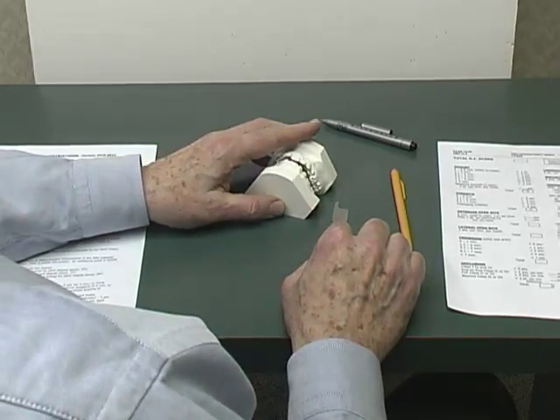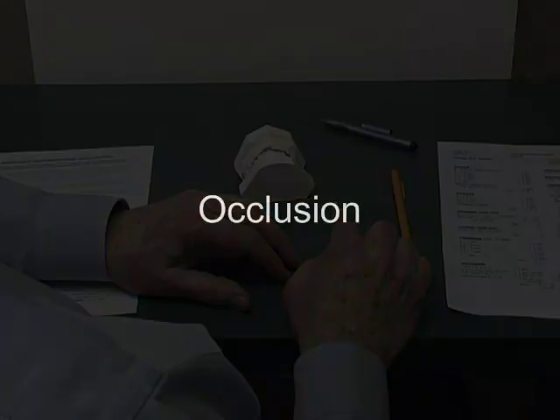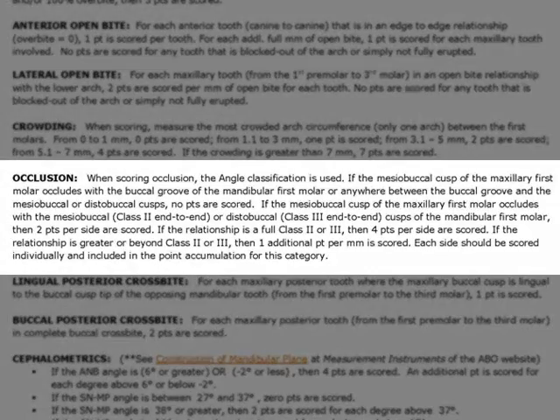Let's skip down to the category of occlusion and measure that on this same set of casts. When scoring occlusion, the Angle classification is used. If the mesial buccal cusp of the maxillary first molar occludes with the buccal groove of the mandibular first molar, or anywhere between the buccal groove and the mesial buccal or distal buccal cusps, no points are scored.